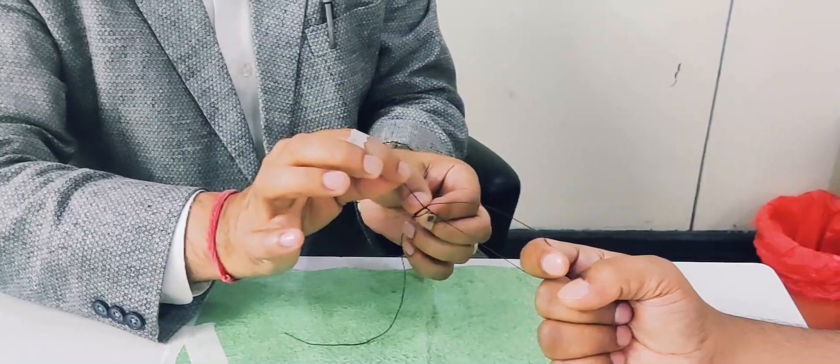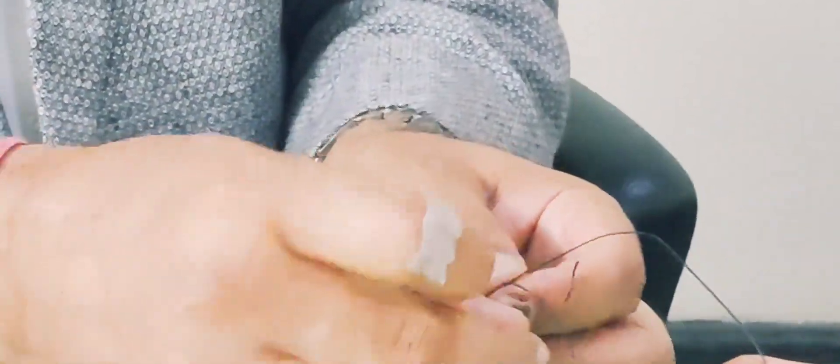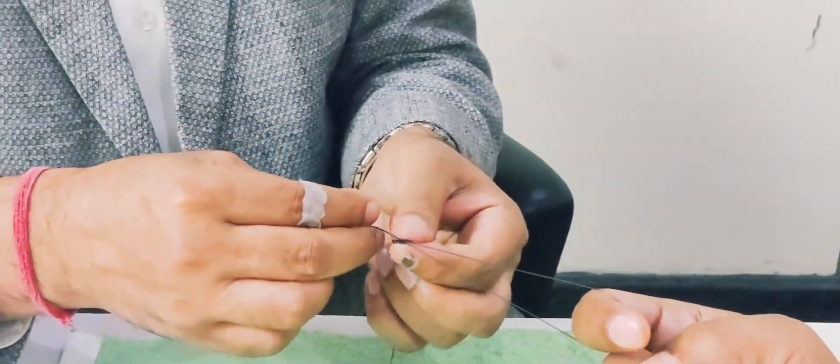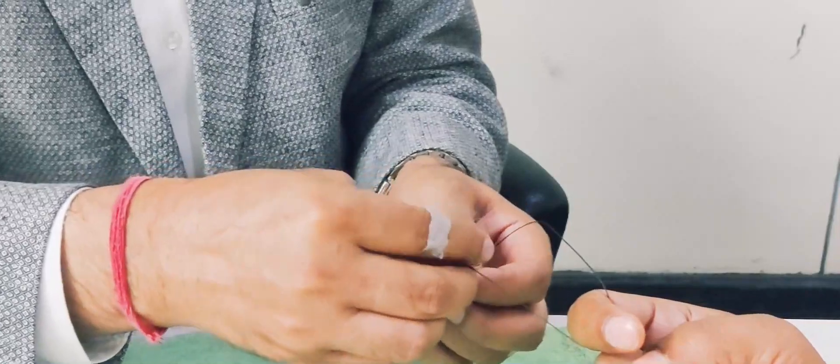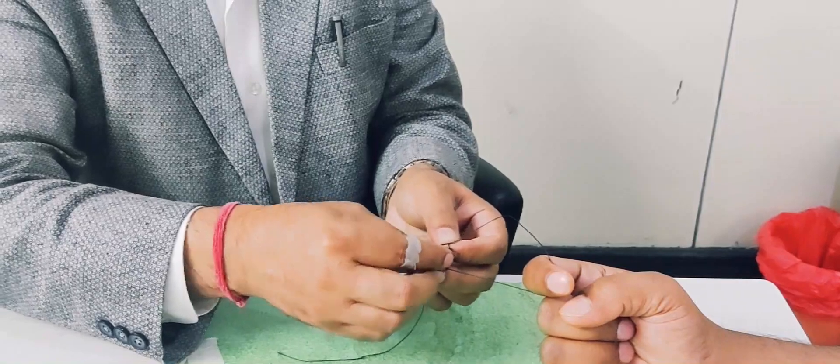After this half knot you will do the one full loop. After this, there will be a half knot. Like this. This is the half knot.